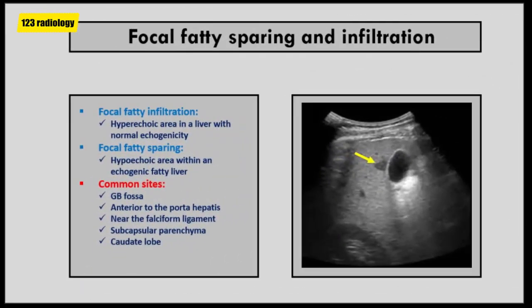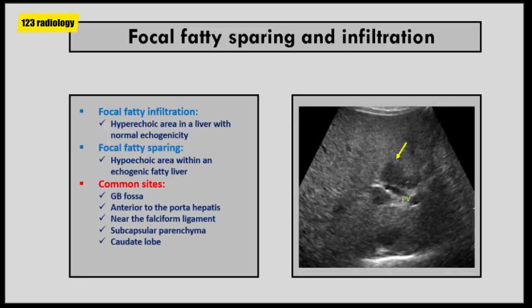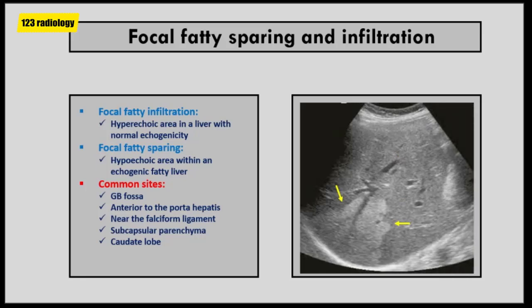Although the process of fatty infiltration is usually diffuse, fatty deposition or fatty sparing may be focal, resembling a mass. Focal fatty infiltration is a hyperechoic area in a liver with normal echogenicity, while focal fatty sparing is a hypoechoic area in a hyperechoic liver. Focal fatty changes are usually seen in characteristic locations. A typical common site is the gallbladder fossa — the liver may show diffuse increased echogenicity with a hypoechoic area at the gallbladder fossa representing focal fatty sparing. Another typical site is anterior to the porta hepatis, near the falciform ligament, or in the subcapsular parenchyma, or in the caudate lobe.